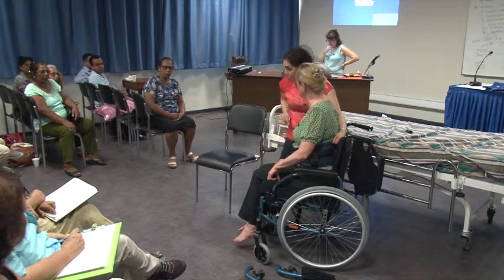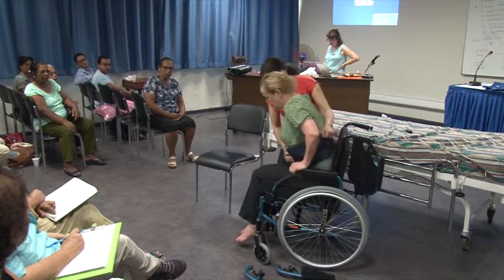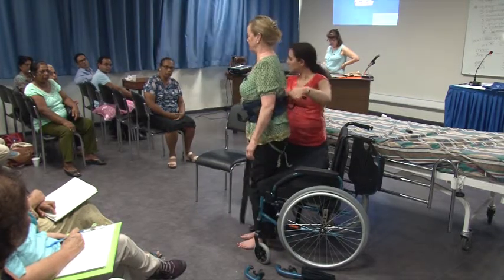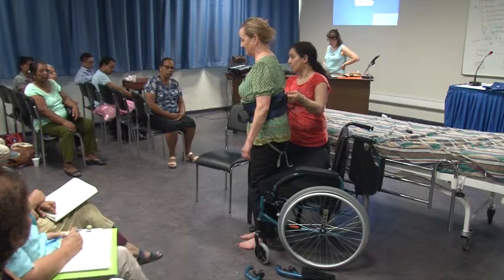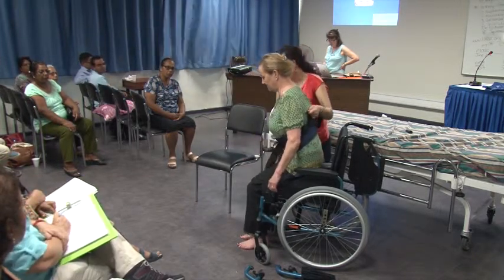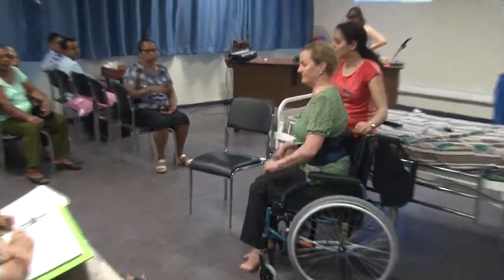So I'm going to ask her to push down. She could use the armrest as well. Push down, and I have got the grip here to stand. So this is what the handling belt is for, okay? To give you that grip and stability. And likewise, you can come down to sit down, feet back, sit down, and control. Okay? So that's what the handling belts are for.